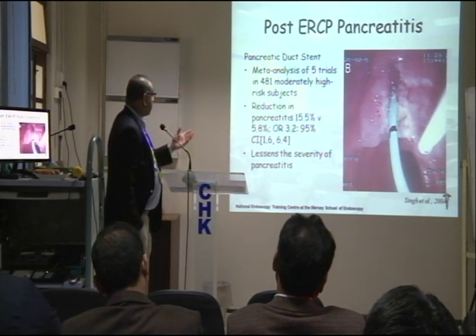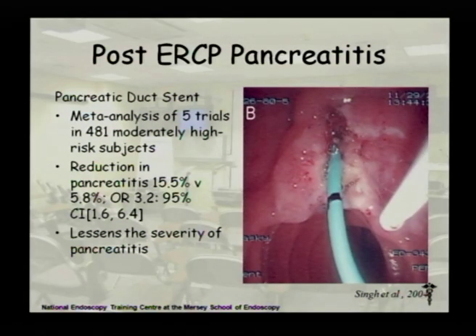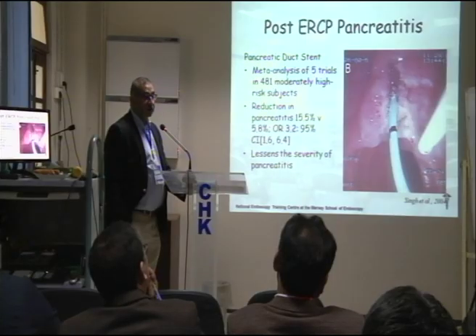Again, we mentioned the pancreatic duct stent. The important thing is don't put it in unnecessarily. Don't do unnecessary pancreatic duct sphincterotomies.